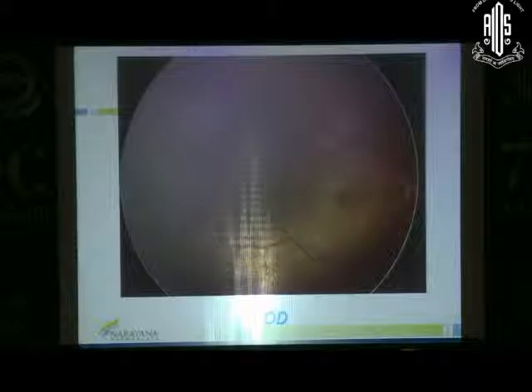To demonstrate that, there's just going to be this interesting case of incontinentia pigmenti, very obvious with the pigmentation on the skin and the axilla. Now, what's important here is the neovascularization, which is fairly obvious clinically and on the angiogram itself. But what is important here is the other eye, I don't have the picture here, looked almost normal, but had a small NV inferiorly as well, which may have been missed out clinically. So IP is a bilateral condition, and to expect it to be asymmetric is okay, but to expect the other eye not to be involved at all is kind of not usual.